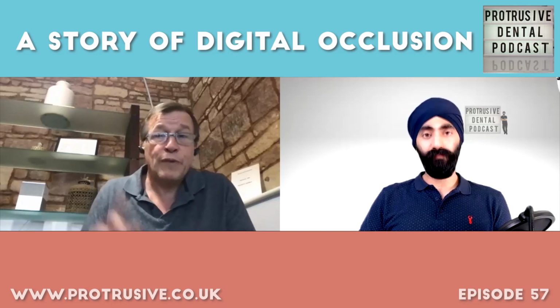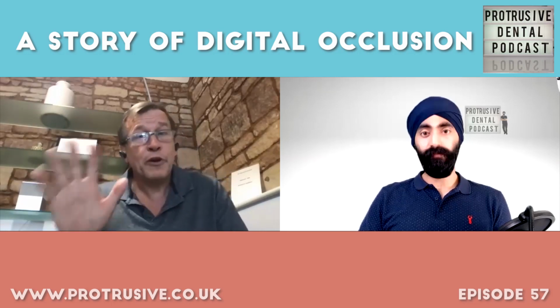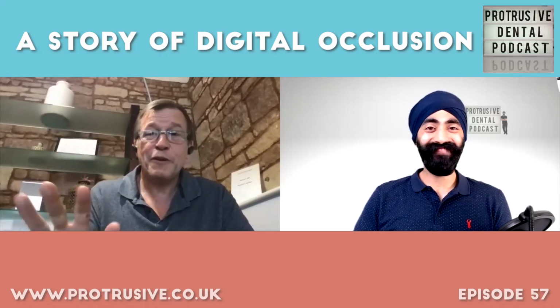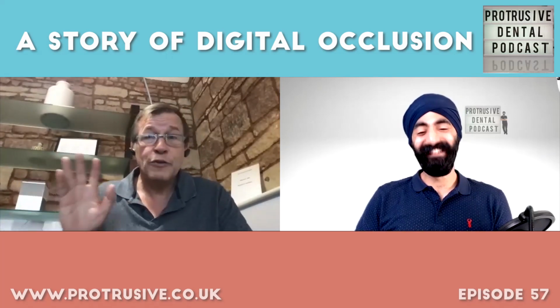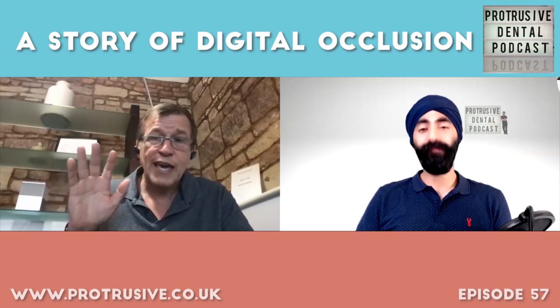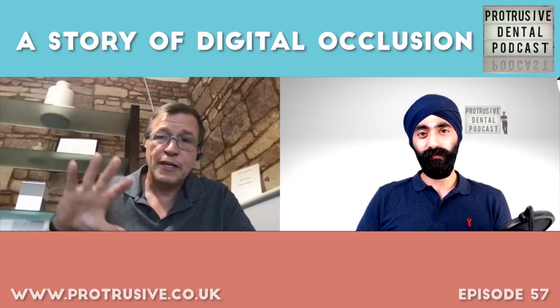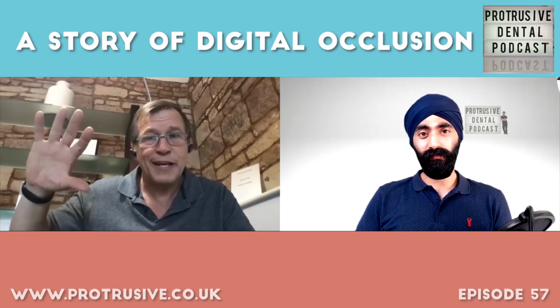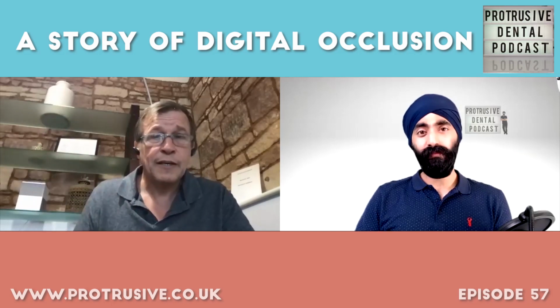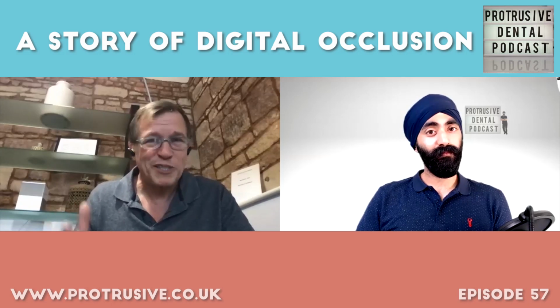Now, for that, here's what I'll take, is I will take scans. Now, for those of you, because I was only joking before, I know loads of people listen to you. So for those of you who are analog and would like to stay analog, you can still take impressions, and we can have those scanned by the technician. Okay, so you can get into this whichever way you want. For me, the real power of digital is in wax ups and treatment planning, etc. So you can take an impression and have it scanned. Obviously, I'm hoping that eventually you just say, "Oh, it's a waste of time. We should just get a scanner."